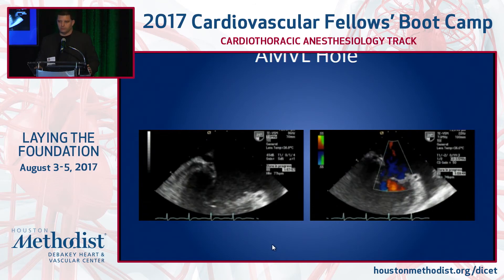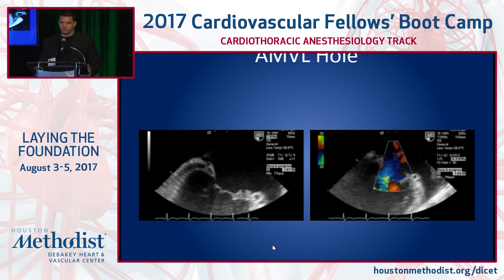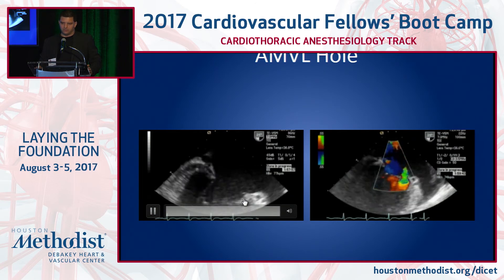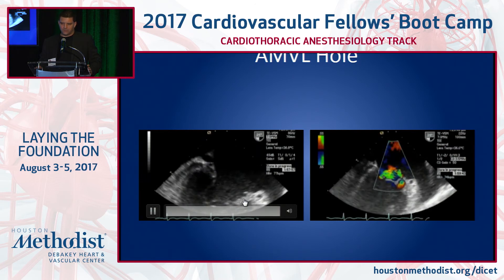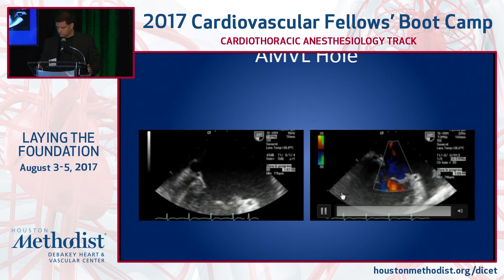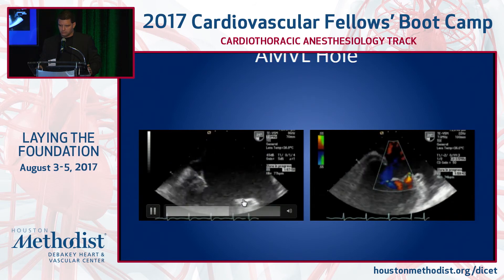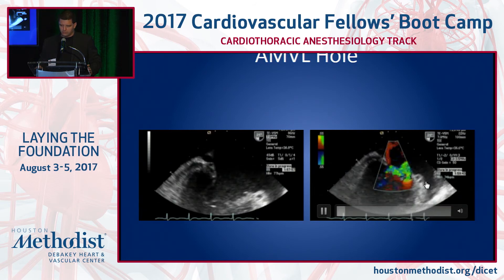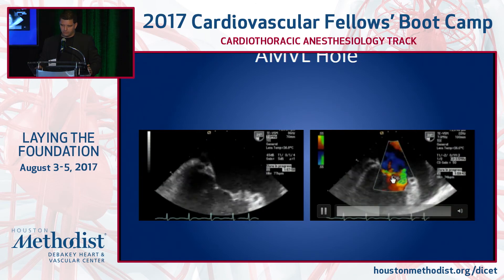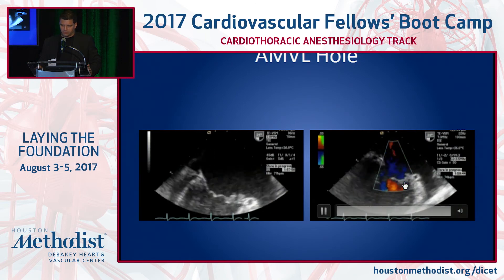This is one of the interesting situations, which is fairly difficult to diagnose sometimes. You're looking at a hole in the anterior mitral valve leaflet, probably in a two-chamber view of the mitral valve in midesophageal position. The patient has mitral regurgitation. You can see the hole in and out of view, and you can see the jet through the hole. There's also some degree of mitral regurgitation coming through the normal coaptation plane. This patient had endocarditis.